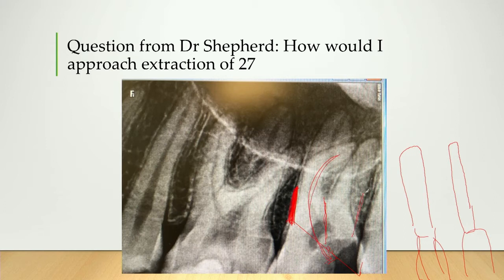You need a nice thin instrument that is about the same size and shape as the trench that you've drilled, so that you can luxate that root out. So I hope that answers your question. Keep them coming.